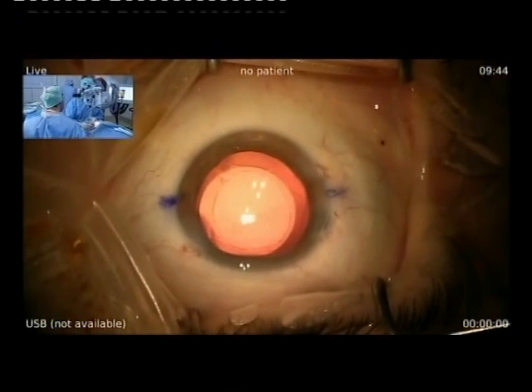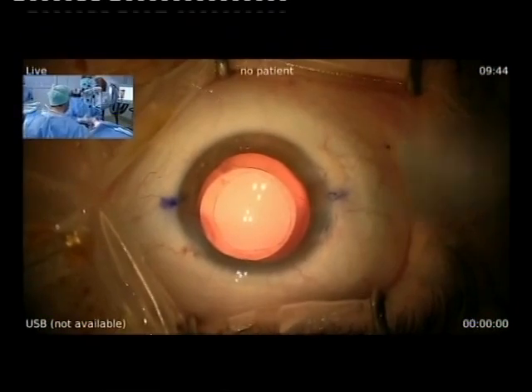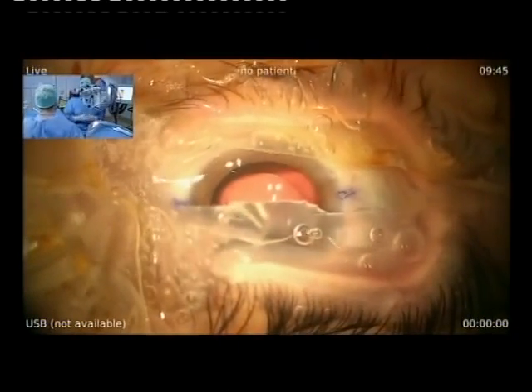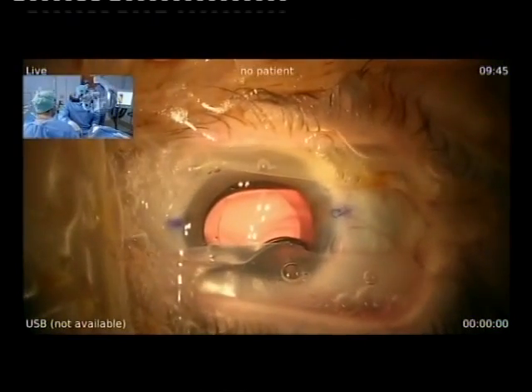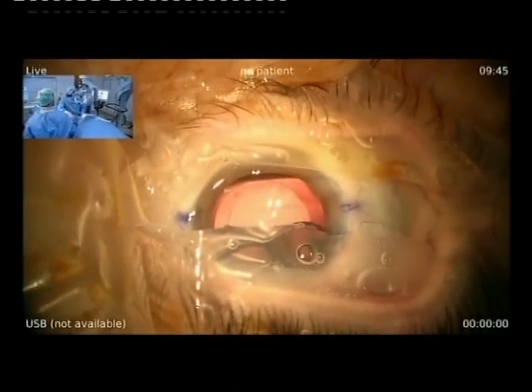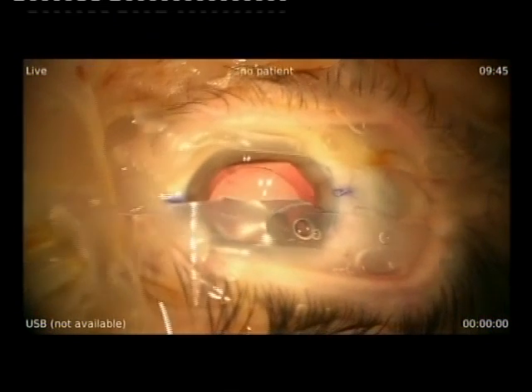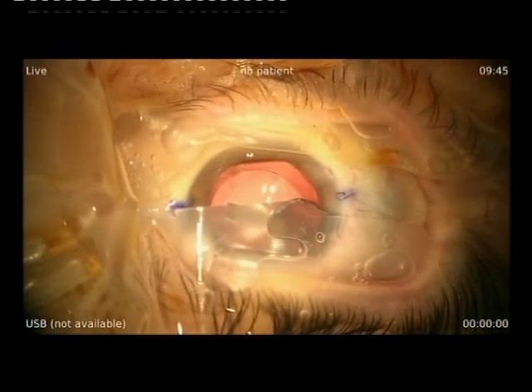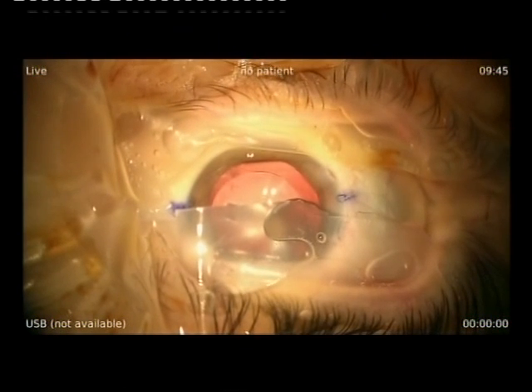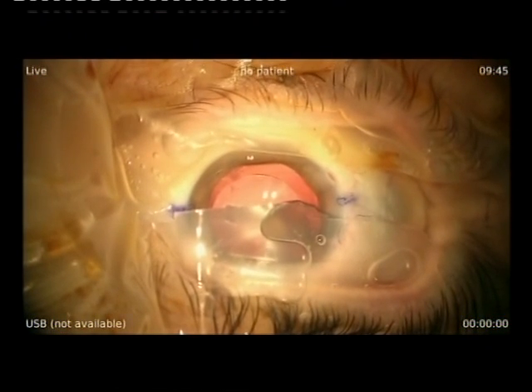The IOL is well centered and the surgery is finished. Do you have any comments on the IOL you're using? Yes — this is the new trifocal from Carl Zeiss. I used to give bifocal lenses to my patients, but since I got this new one I use only this. Patients are very happy with their vision, the intermediate vision is very good, and I have no complaints about halos — the number of halos is well diminished. I think it's because the number of rings is decreased compared to the bifocal version.